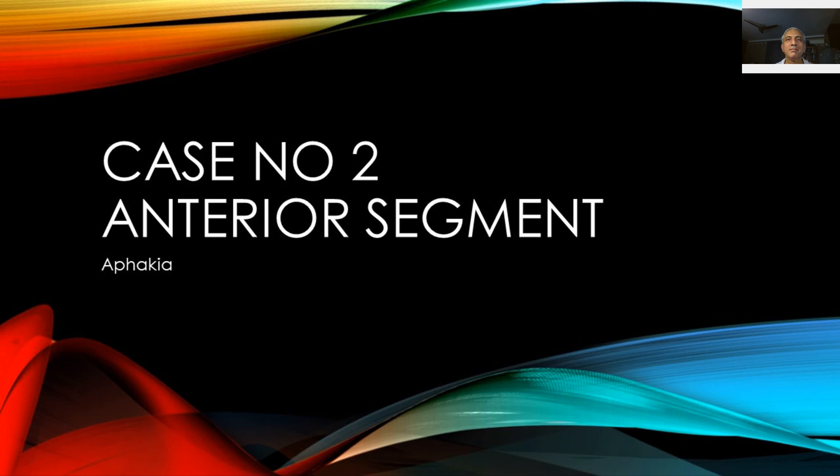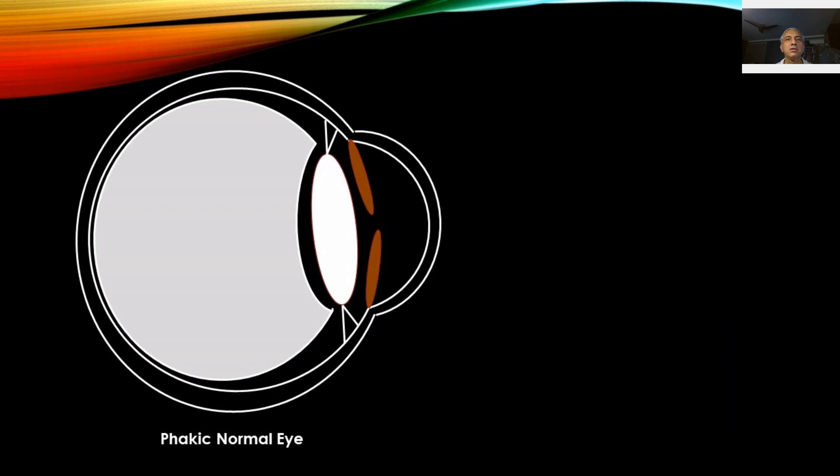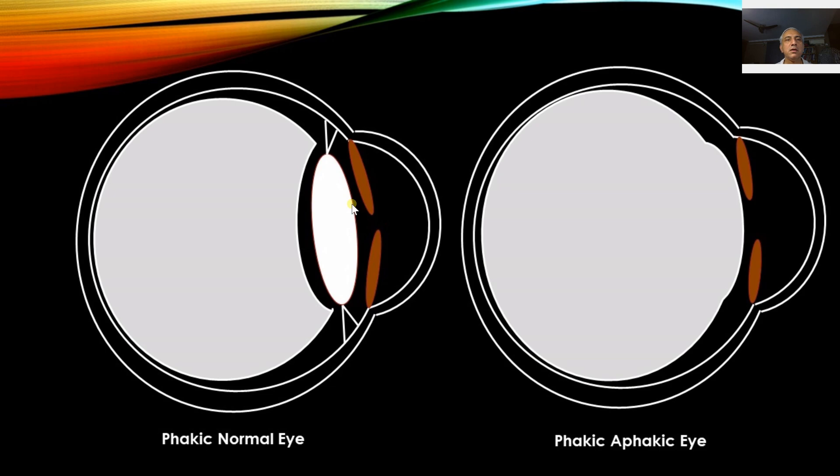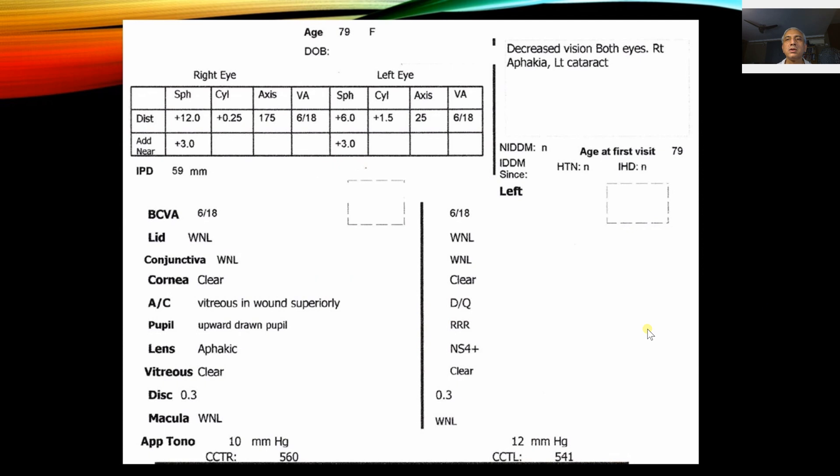This is an anterior segment examination of aphakia using slit lamp with explanations. Normally, the vitreous is shaped concave anteriorly with the lens in front of it, but when you become aphakic, the iris tends to fall backwards and the vitreous is convex forward. If there's loss of vitreous through a wound in cataract surgery, you can see the vitreous causing the iris to move upward or create an updrawn iris.